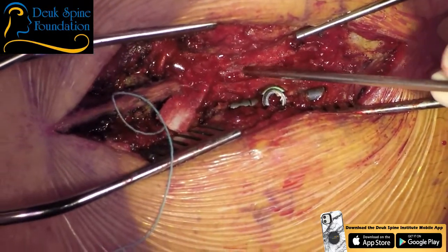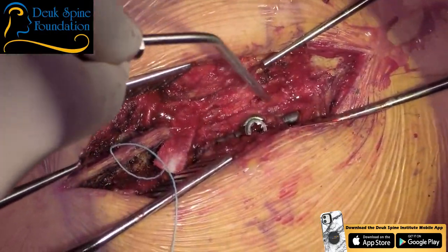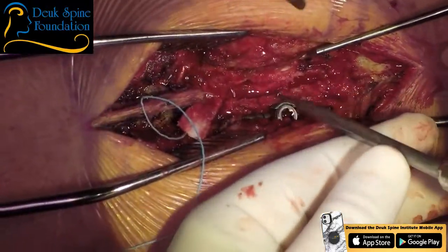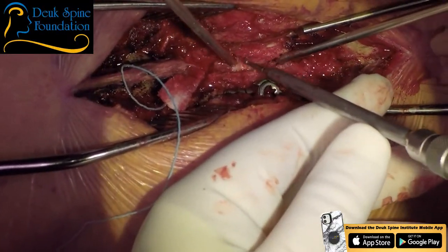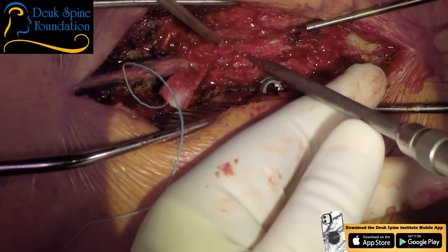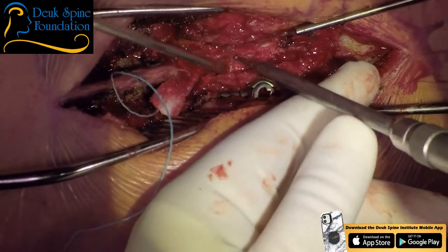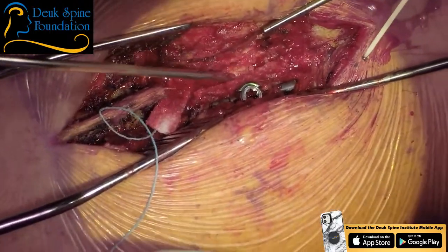What's wrong, Patel? Let me have a drill. Yes, sir. Take this, somebody. Show me here. Gentle, gentle. I'm gonna drill this wall just a little bit. I need another millimeter. It's always better to drill less and then take more later if you need it. But the more I take, the more likely I create instability.